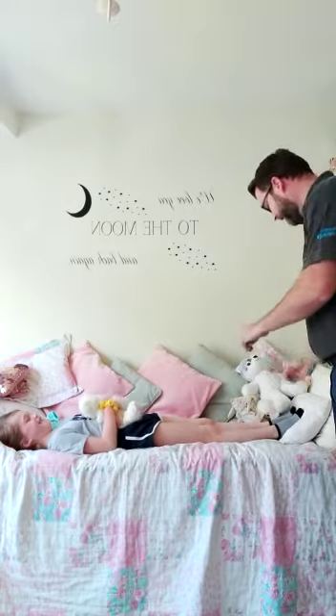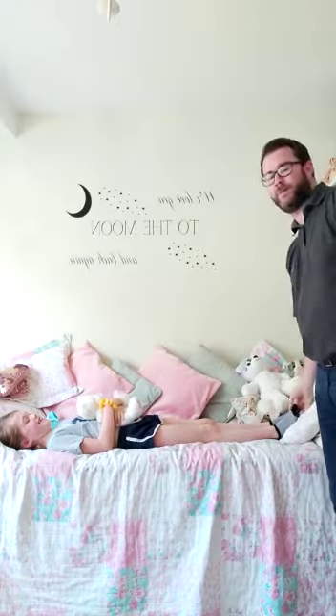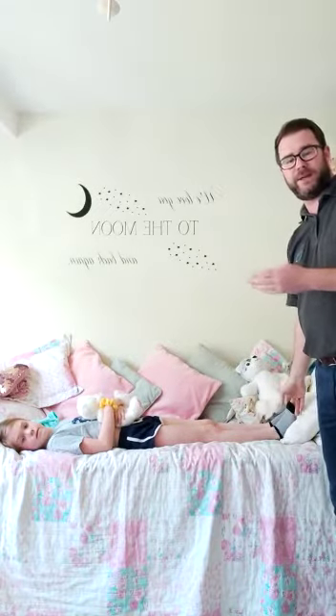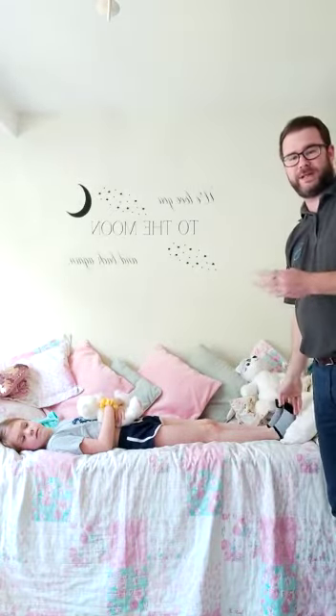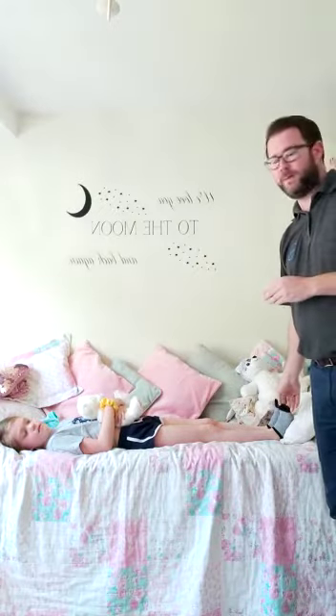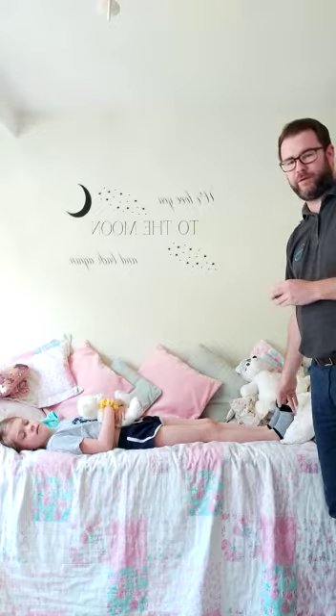We've got the lovely Bella again — hello! Usually you would have some kind of shoes on. You'll take advice from your physio whether you need to wear splints, piedros, or just a standard pair of trainers. But Bella decided not to put trainers on because mummy won't let her in the house with trainers, so we're just going to do it barefoot for now.